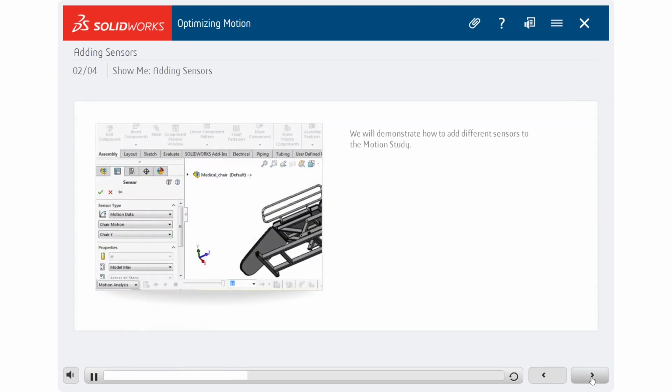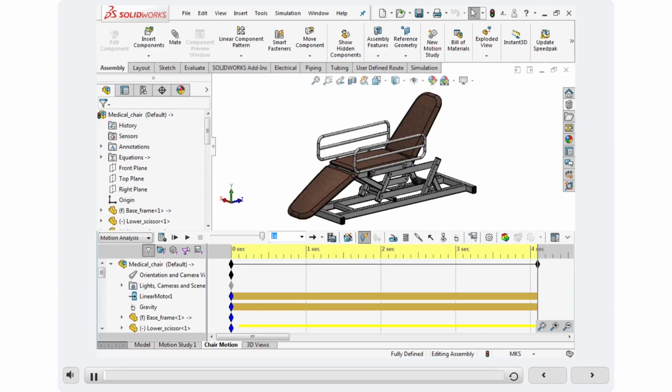Let's see how to add different sensors to the motion study. Click Show Me to launch a demonstration video. In the optimization analysis, two constraints will monitor the height of the chair to ensure that it is able to lift high enough and come down low enough throughout its articulation. These constraints must be monitored through sensors. Before we begin adding sensors, we will first create a plot of linear displacement of the couch center component, which is the tray under the center of the chair in the Y direction.